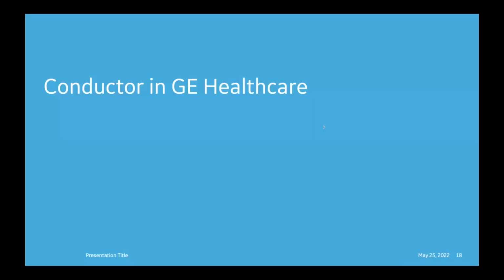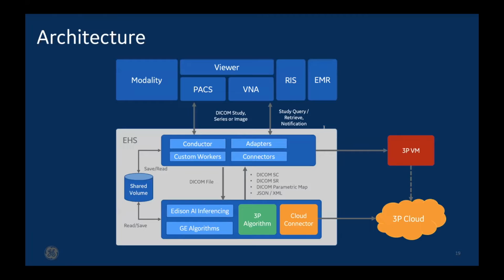Okay, so how Conductor fits in our architecture. Let's separate this picture into two parts. On the top here in blue, you have the modality, which you can think of as scanners, like CT, MR, X-ray, and anything in between. Then the viewer is what the radiologist is seeing.